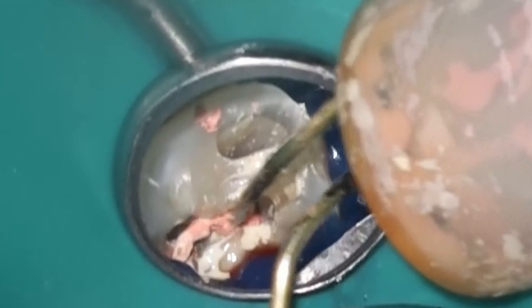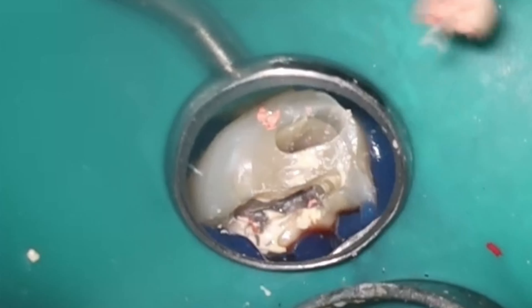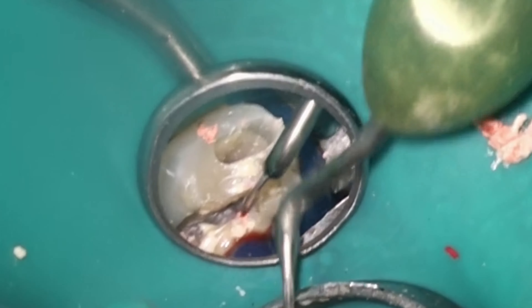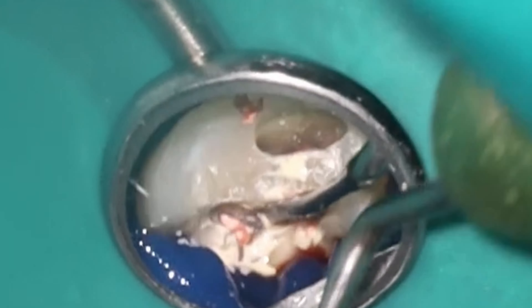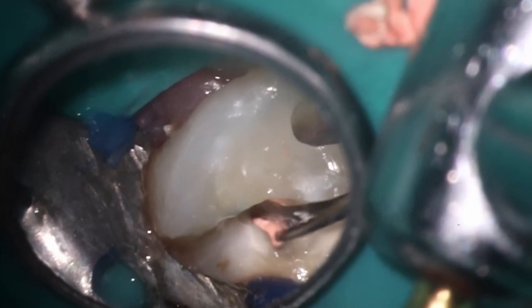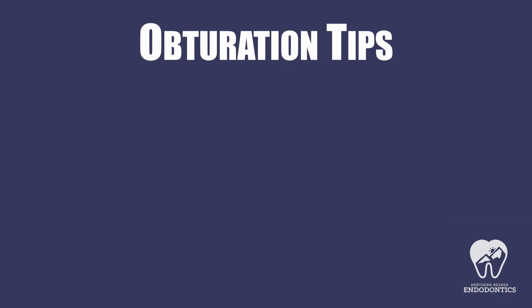For those of you who use cones or single cone technique, I have some tips coming up. But this is pretty much how it works with the squirt technique — the squirt technique does work with really severe curves. After this, it's just fill it up like normal. Once it's all filled up, clean out the excess sealer, pop that all off. In this case, I'm going to go straight in with the Pac-Mac. I'm not going to take it very far down — the reason is because with such a long, curvy case, the chance of a void is very high. So may as well just go right in with the Pac-Mac, and not going very far either, primarily because we want to make sure we don't break anything off.